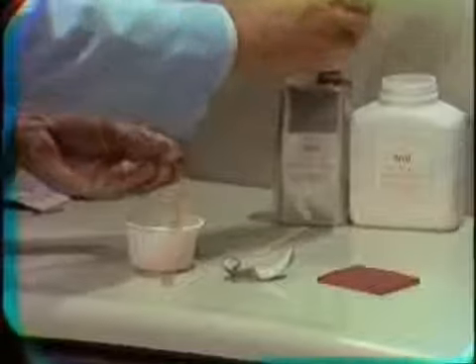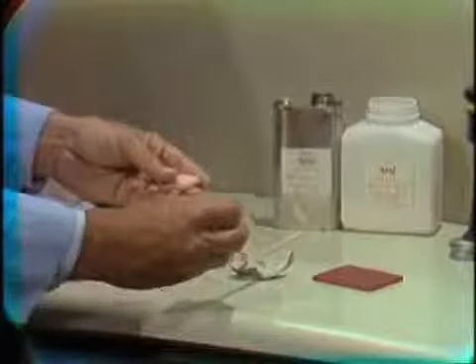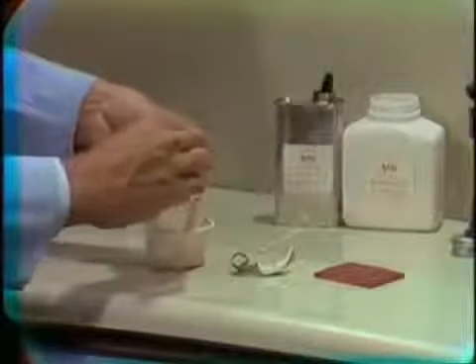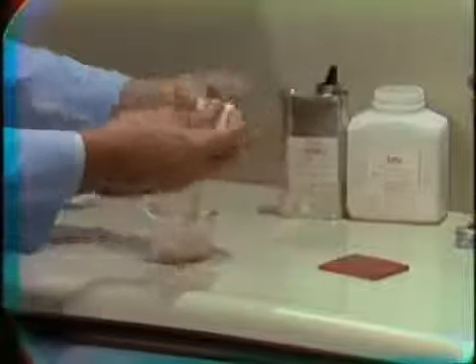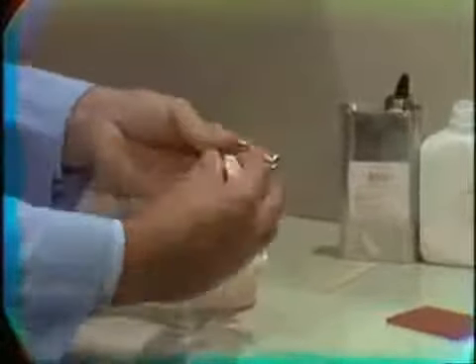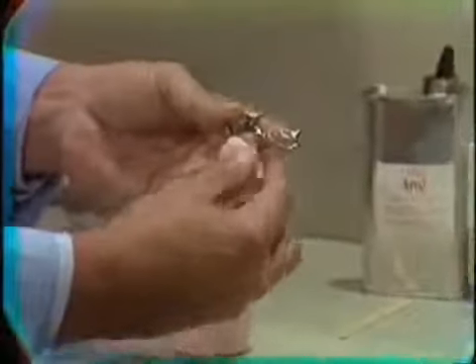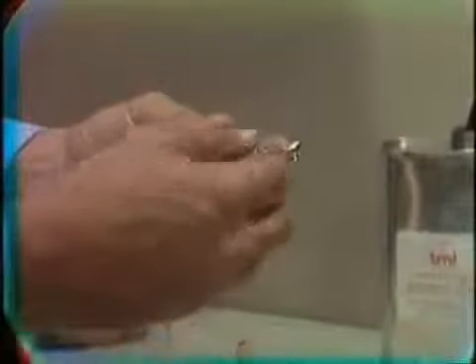And we're just going to make a little roll out of the doughy acrylic. Sometimes it's advantageous to wet the base just slightly with the monomer so that it ensures adhesion. And the object of this is to put an occlusal table on that is of adequate width so that the entire opposing tooth will be recorded.